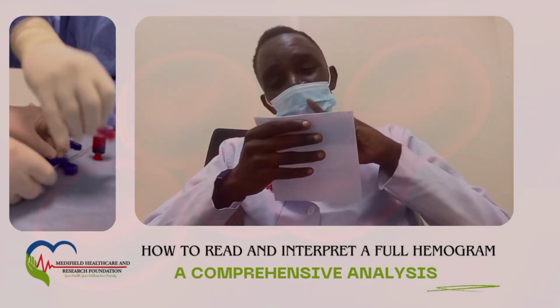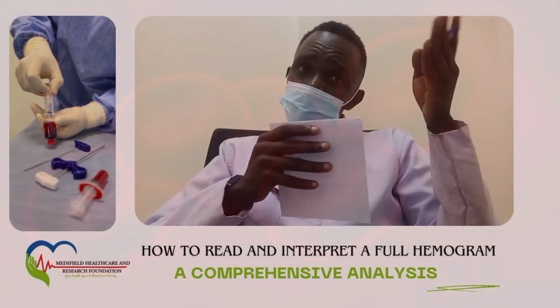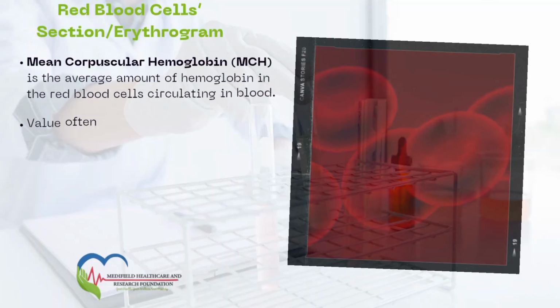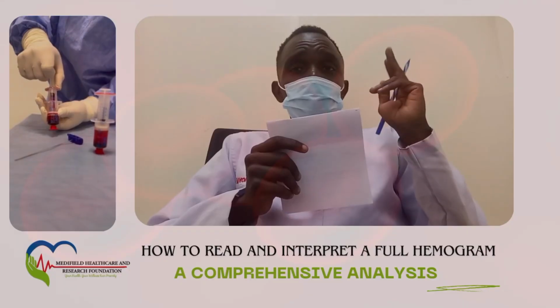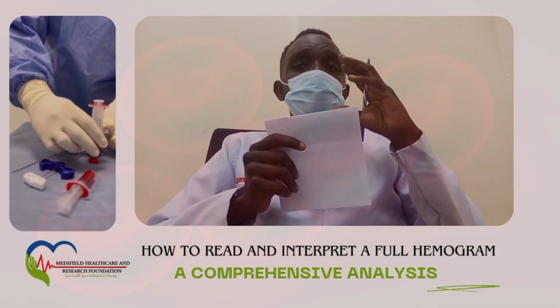If we have all of them at normal ranges, then we have normocytic normochromic anemias. All that derangement are used to classify those anemias as either hyperchromic, normochromic, or hypochromic. So you need to understand when the HB count is low, you have to look at the MCH and the MCV and try to look which picture of anemia is brought out by that.